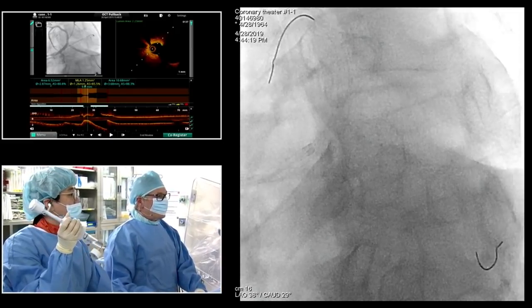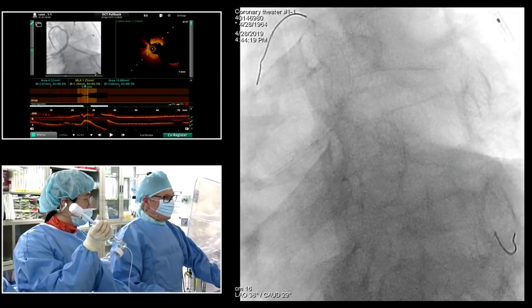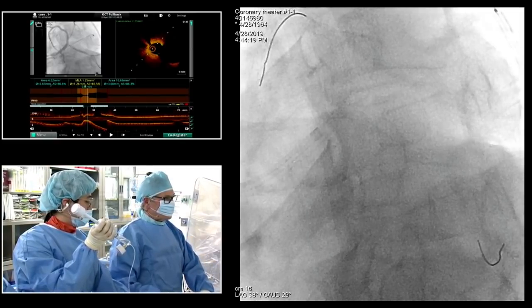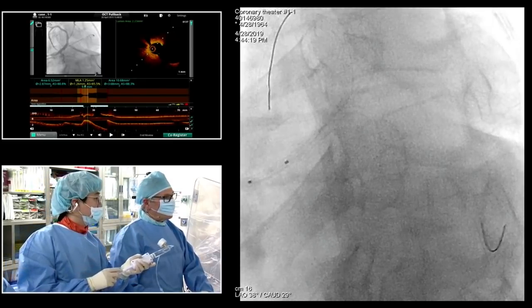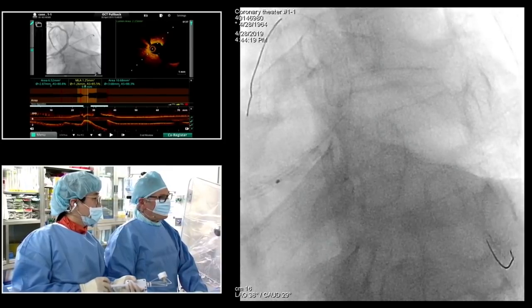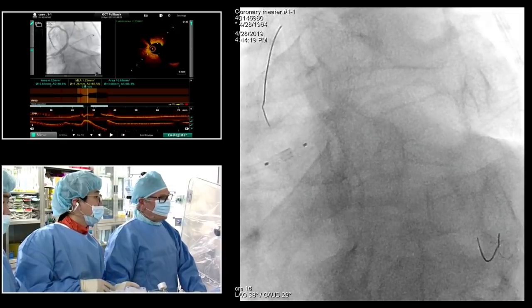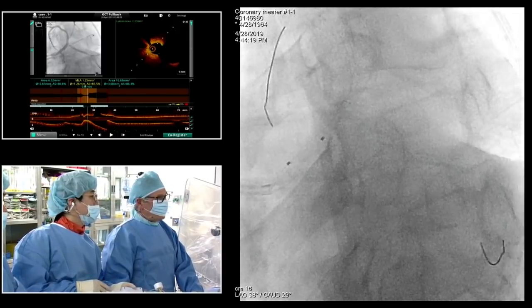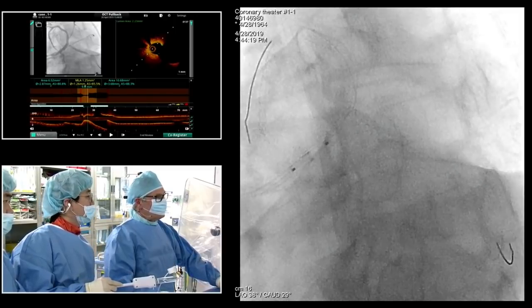The crush makes it much more difficult to expand the stent anyway. If you do a two-stent technique, we have to promote the quality of the two-stent technique as high as possible. So what would you do? Doctor, the next step is to do dilatation with a cutting balloon. You see, it's not easy to advance.